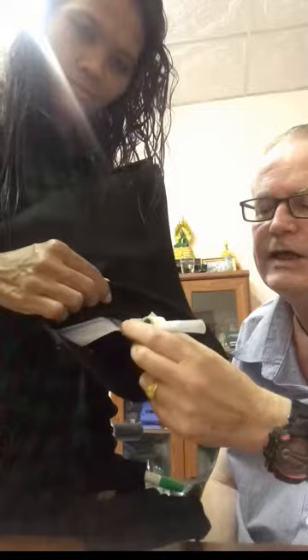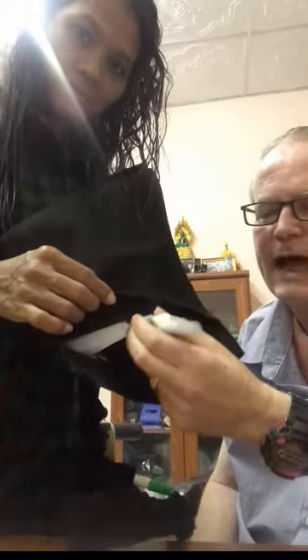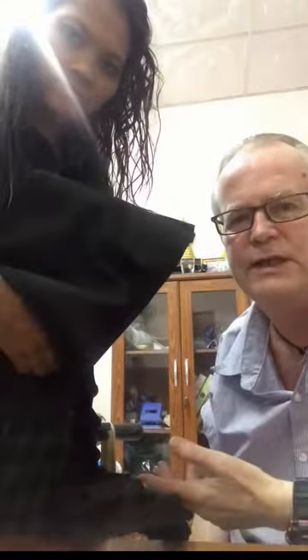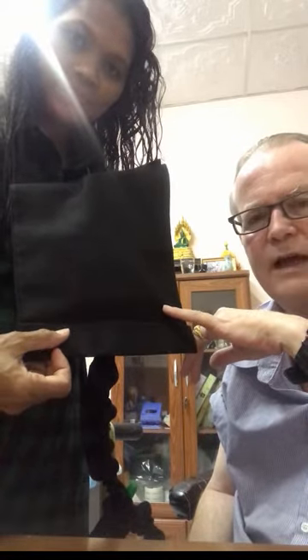Now empty it. The important thing here is that when you put this outlet pipe away, you fold it up back into the bag, and you do that for two reasons. One, we obviously want to disguise it as a catheter bag. Secondly, when a bag gets full of fluid it puts an awful lot of pressure on the outlet pipe and they're liable to leak. By folding it up, you're going to reduce that pressure greatly.